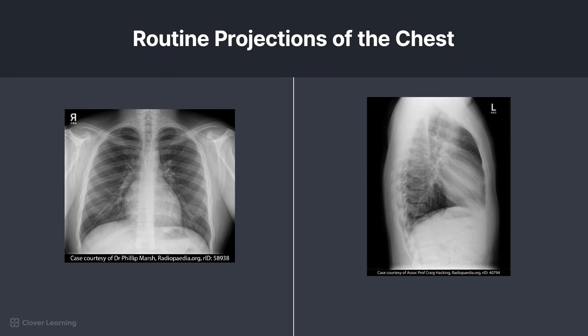In summary, the routine radiographic projections of the chest include the PA and lateral. Obtaining clear, diagnostic-quality images of the chest can help identify fractures and other pathologic conditions. Identifying and recognizing the relevant anatomy is the first step in ensuring the evaluation criteria are met.